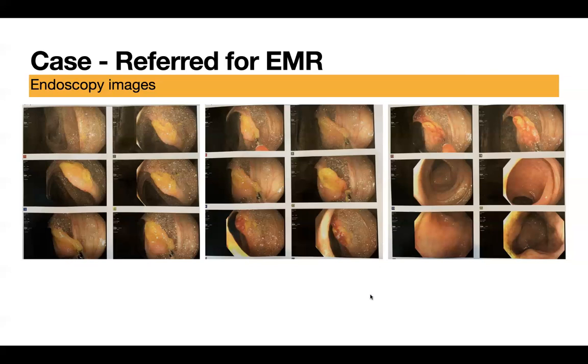Dr. Raju, if I may ask a question. Please. I don't particularly see a good view of the cecum. It could have been because of the redundant left colon, but maybe the first picture is of the cecum, but you really don't see it. You see the proximal ascending colon, but document-wise. Right. You're right.